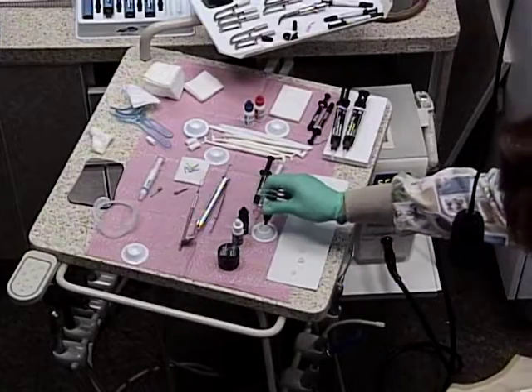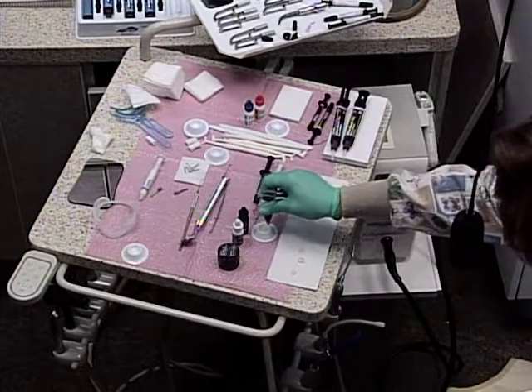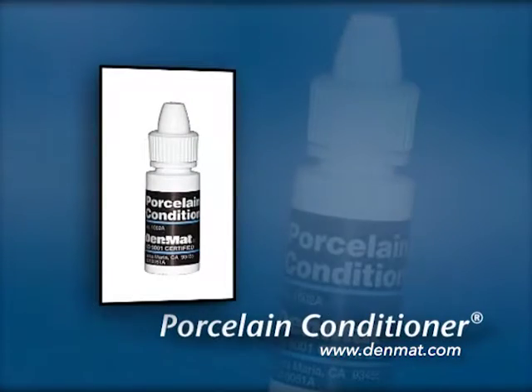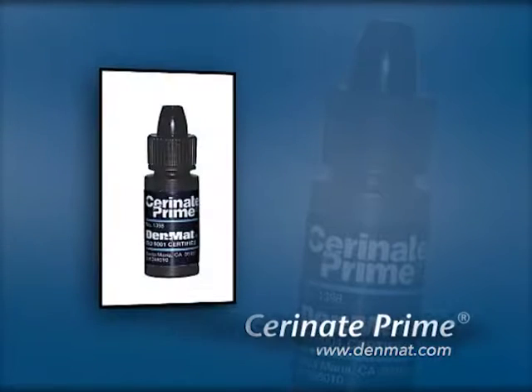Everything is set up on this table. The porcelain has been pre-treated with porcelain conditioner, which is citric acid, and then we follow that with Cerinate Prime. That way your silane is activated right just minutes — about half hour or so — before we place these veneers.